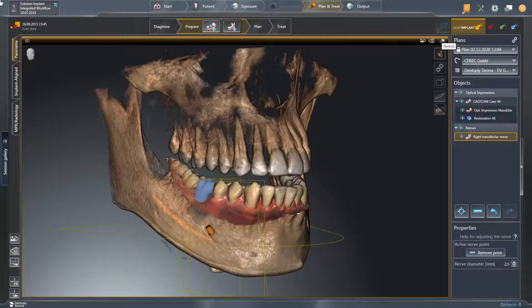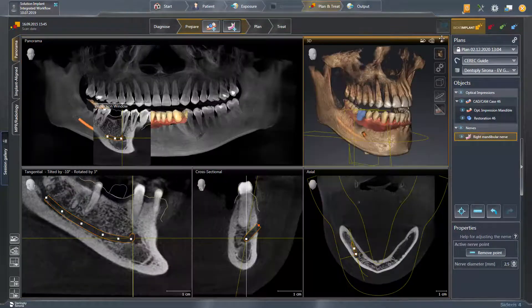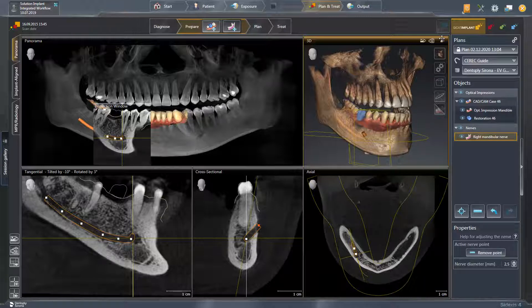We close the full view and show a few more additional functions. By clicking one of the set nerve points and simultaneously holding and moving, the nerve point and thus the nerve path can be adjusted.